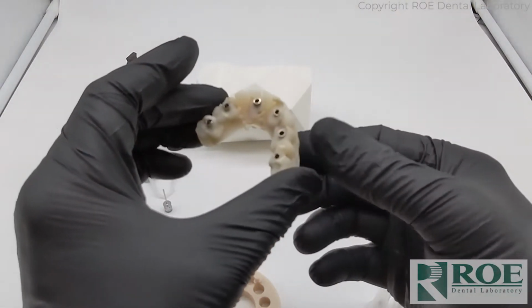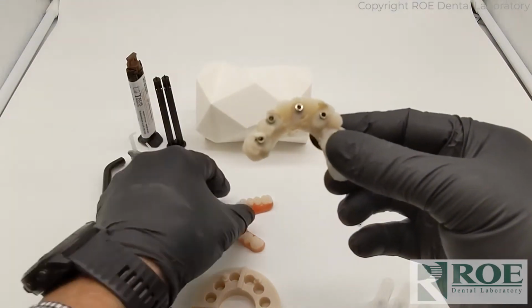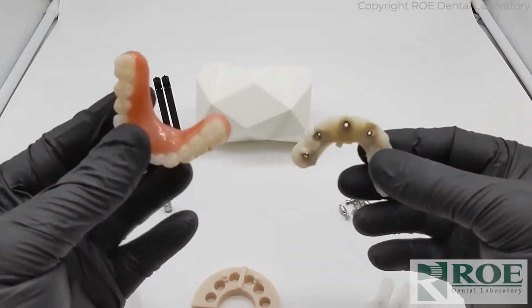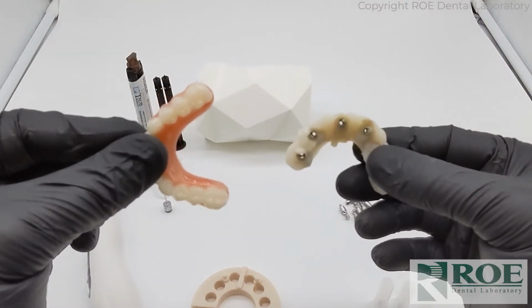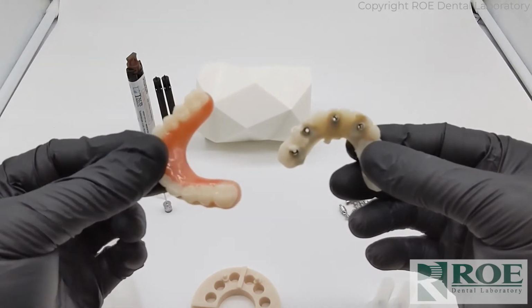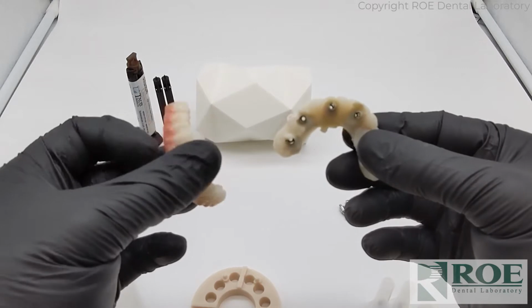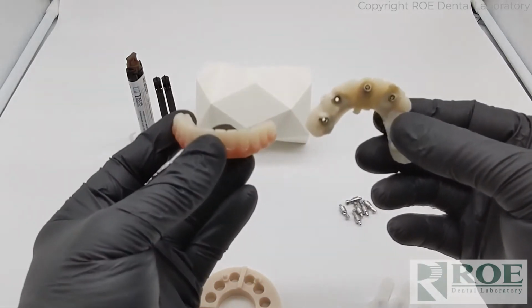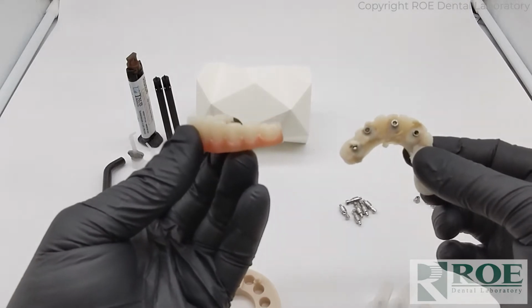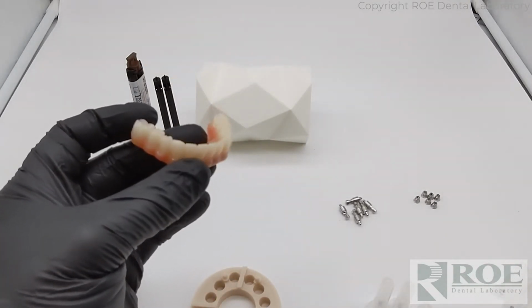Now during surgery, if there was any bite discrepancy, you could have taken a bite on the take-home prosthetic. So in other words, you would seat this on the carrier guide, either really early in the process when you first put the carrier guide in, because then the muscles aren't sore and stretched from going through the whole surgery. You could seat this on the carrier guide and take a bite. And that way you could do an extra oral conversion with this on the roto model.